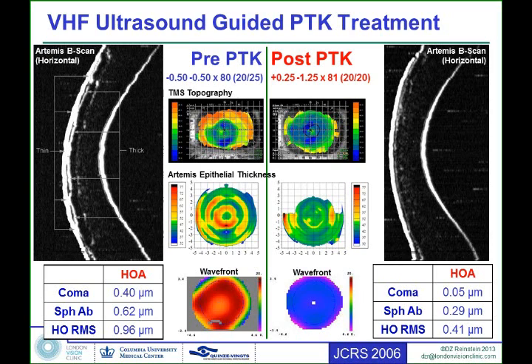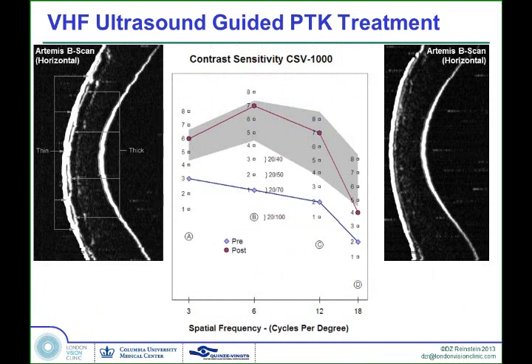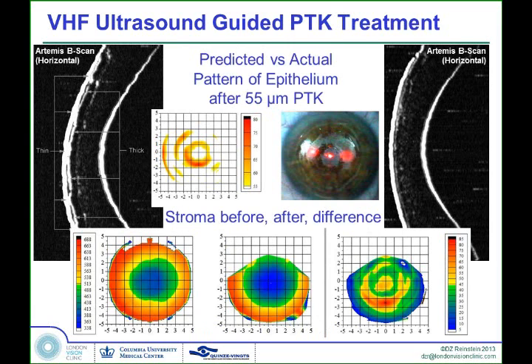A wavefront-guided profile on top of that was placed because he had no angle kappa, and we knew that the epithelial irregularity was not going to produce a refractive change because it was just rings. And so he ended up with a phenomenal one-time slam dunk outcome, with high normal contrast, by separating the very, very high irregularities, which are like 64th order aberrations, if you like, which is kind of scatter, really, as opposed to the wavefront, which is up to the 6th order, where the human being detects things. And this is an example of how you can combine these techniques.